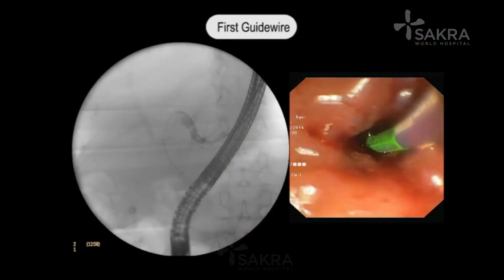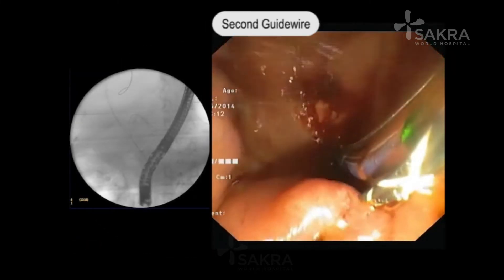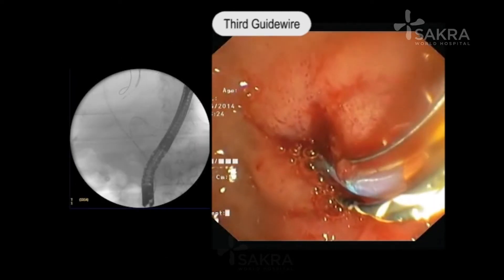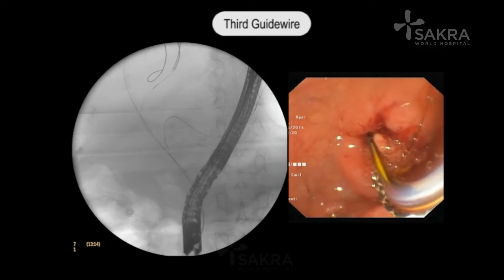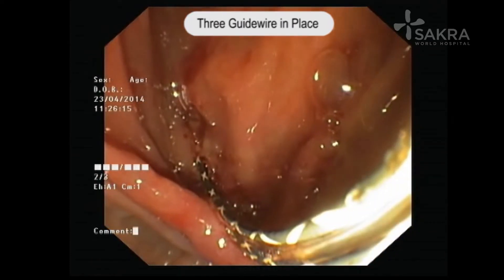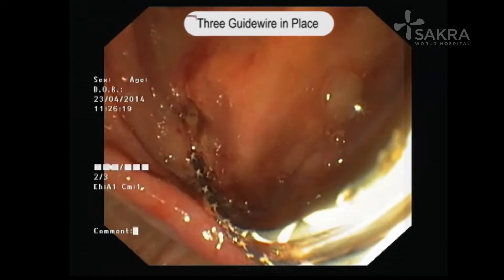You can see the wide open bile duct opening. We are using a sphincterotome under fluoroscopic and endoscopic guidance and placing a wire. Under fluoroscopy, the wire has been placed deep into the right hepatic duct. We then hold that wire in place, use the sphincterotome to place one more wire into the left system, and a third wire deep into the right system again.